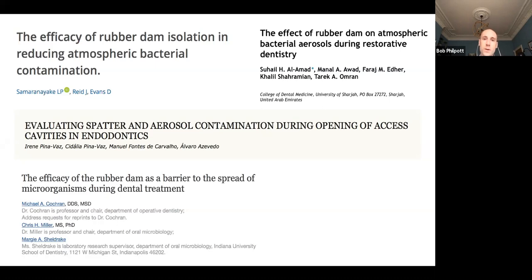I think our protocols in terms of rubber dam will change slightly, but one principle that will become way, way more important is it should be put on correctly. You can't have it leaking from within the oral cavity for obvious reasons. You ideally should have it positioned correctly on the patient's mouth so that it's not resting down with a large portion of the mouth that is open. Historically, that was because people didn't want to drop files or various things in there. For me, practically, it never worked because it meant it was too taut at one aspect and it was too difficult to get the instruments in. So it had a profound effect on your ability to access and find canals.